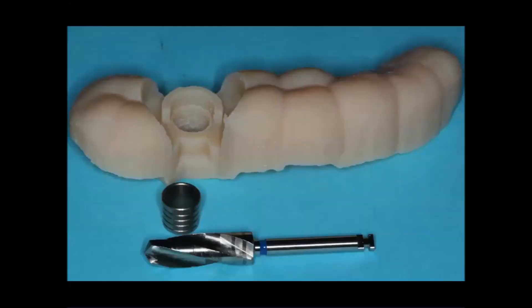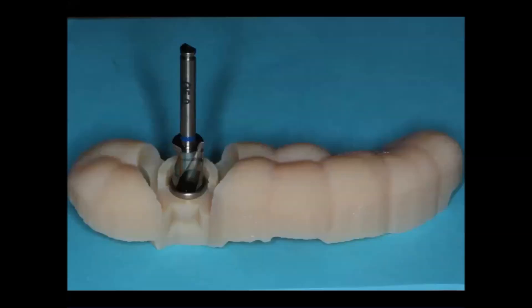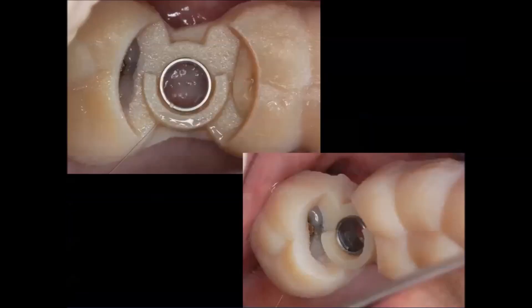All that's left to do prior to the surgery is to put in the appropriate guide tube — I'll often place a drop of super glue prior to placing it, just so that it won't tend to come out during the procedure as I'm drilling. Here you see the tube in place with the one cut drill inside of it. These have a very intimate fit, allowing for creation of the final diameter osteotomy with just a single drill. And here you can see the fit of the guide being verified in the mouth prior to surgery — again, this should fit exactly as it did on the model.